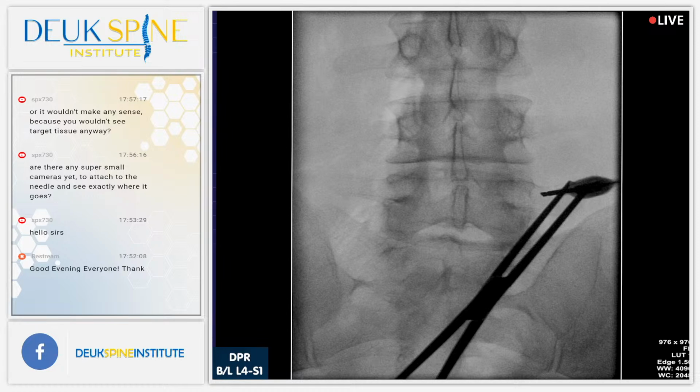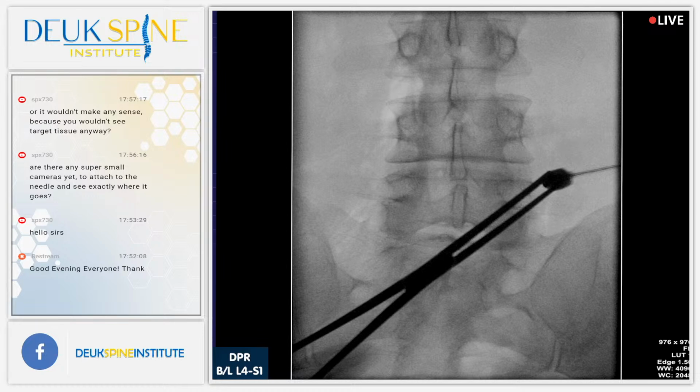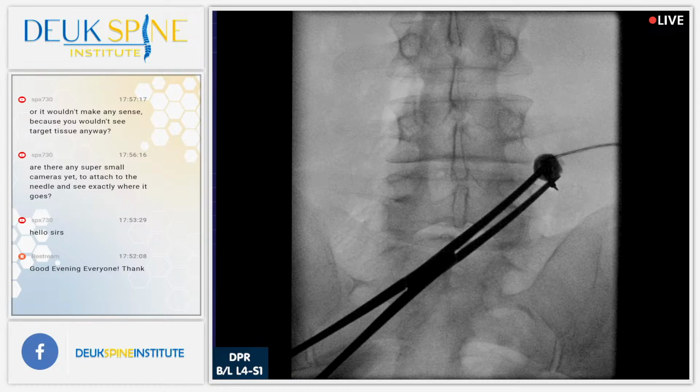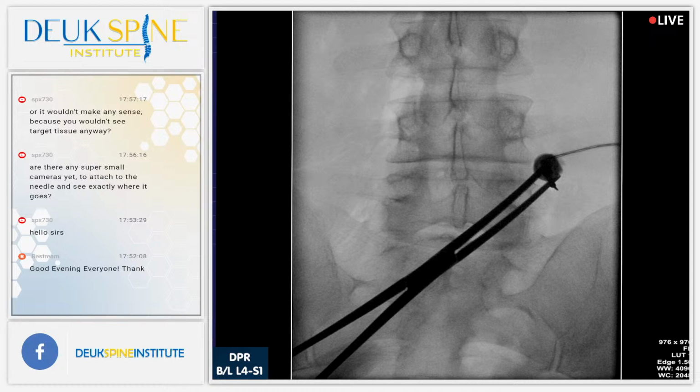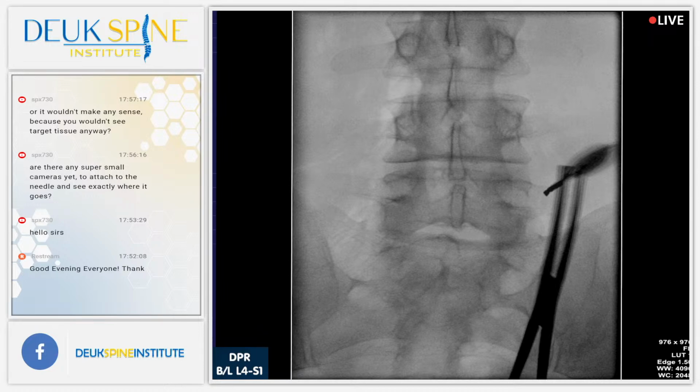I actually feel the TP. I feel the mammillary process. Shot. A little bit north. I want to be right on it. Shot. I want to be a little more medial. Shot. That's perfect right there. I could feel the bone.